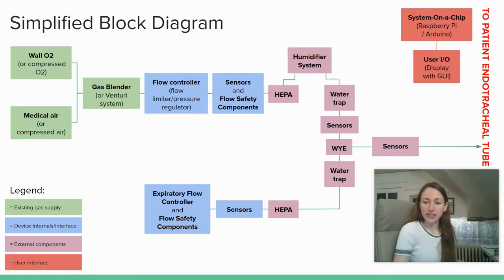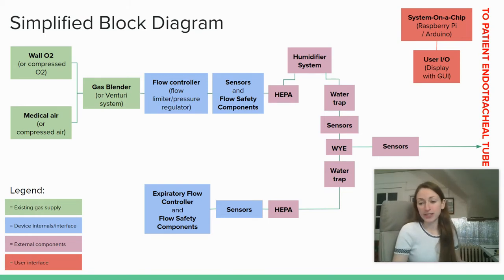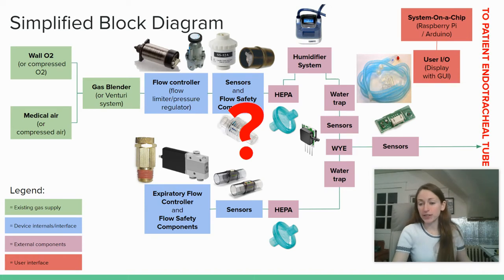Moving back into the device internals, we'll have additional sensors. Here you'll find your expiratory flow sensor, as well as additional flow controller components. And this may include your PEEP valve and your high frequency solenoid, whatever you have going on in here. So this is the rough scheme. And the question is, how do we go from this sort of conceptual block diagram to a bill of materials that we can go out and order and assemble into a working device?